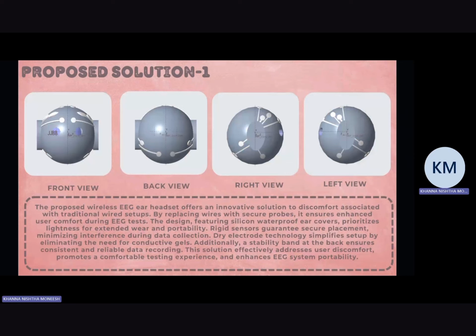The proposed wireless EEG ear headset offers an innovative solution to discomfort associated with traditional wired setups. By replacing the wires with secure probes, it ensures enhanced user comfort during EEG tests. The design featuring silicone waterproof ear covers prioritizes lightness for extended wear and portability. The rigid sensors guarantee secure placement, minimizing interference during data collection.